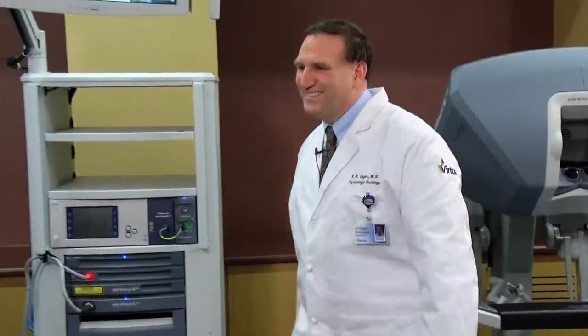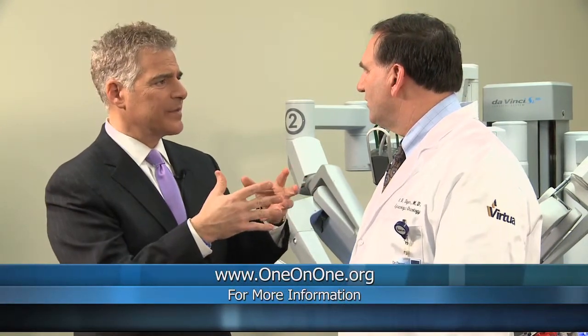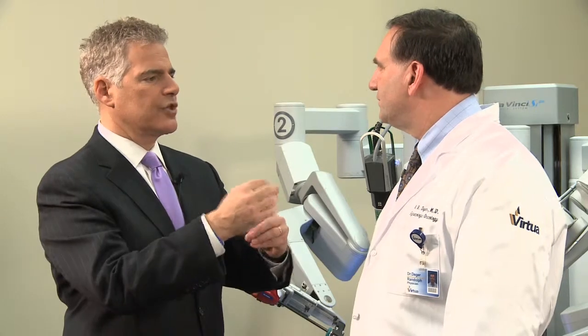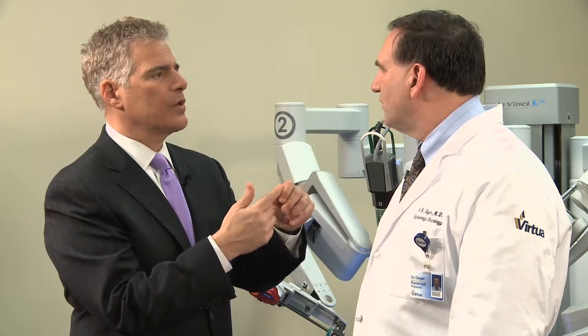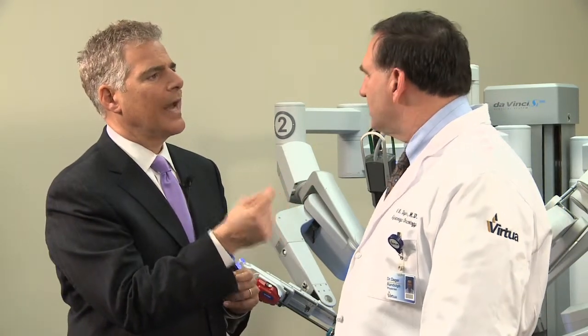First of all, that was fascinating, what you just showed us. But one of the things I want to get at right away, you talked about all the advantages. I put my finger in there, and it was amazing, the scale, the difference. Is it 10 times bigger? 10 times. Yep. But the one thing you said that I know people need to understand is that one of the challenges has to do with what you could feel and what you couldn't feel. What language did you use? Haptics. What does that mean?